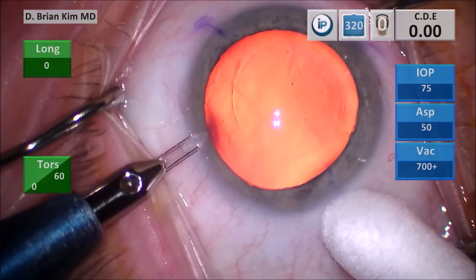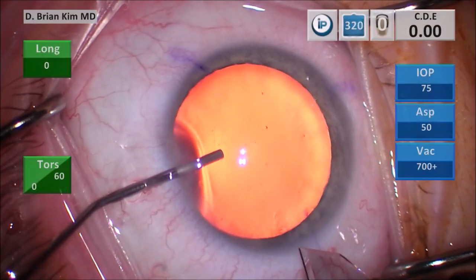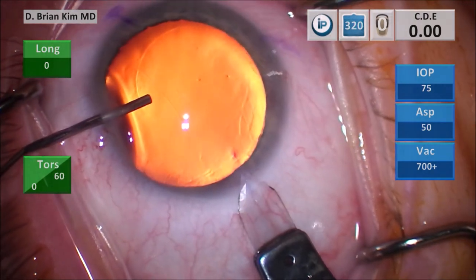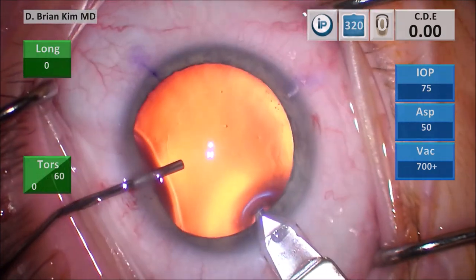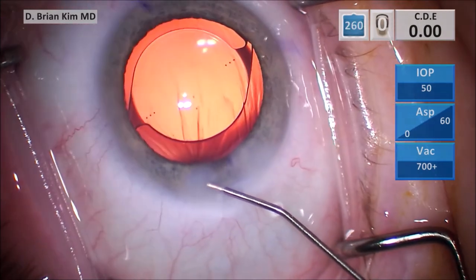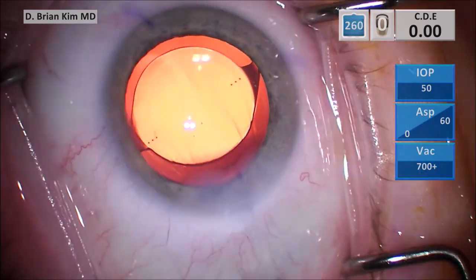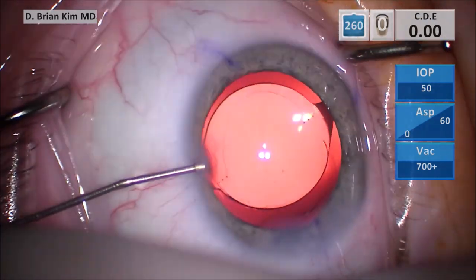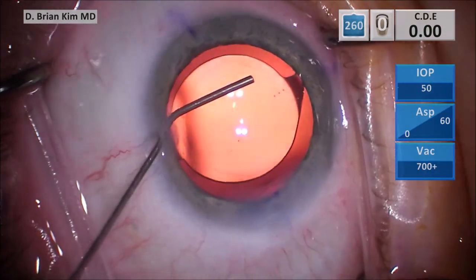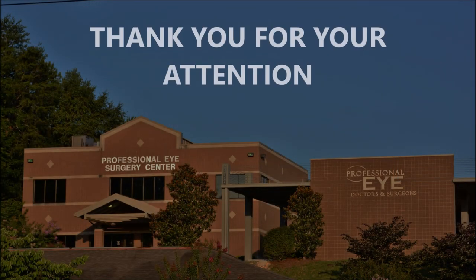Remember, without that groove, you have just a little sliver — a wedge of epithelium and a thin layer of stroma — which provides no structural integrity and just kind of flops around when you try to lift it. If you make that groove, it's actually pretty strong and rigid, not dissimilar to a femtosecond LASIK flap that has a nice vertical aspect to the edges. This provides extra strength. When you're able to hydrate the roof of the incision, that fortifies the strength of the main wound. I'm confident that if you follow the principles in this video, this should drastically reduce the occurrences of a wound leak and your need to stitch the wound closed. I hope this was helpful — thank you for your attention.